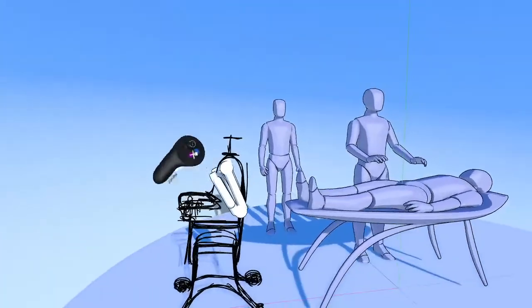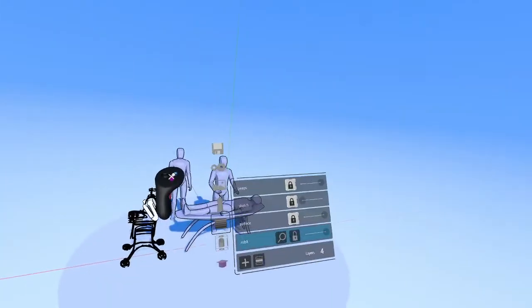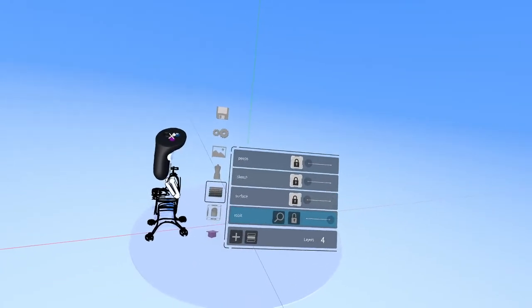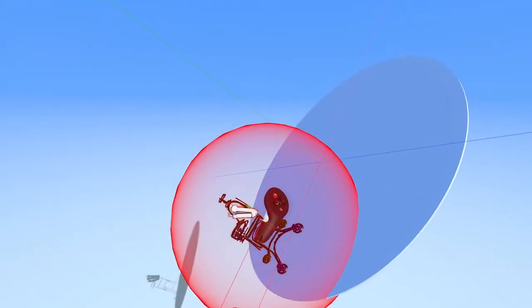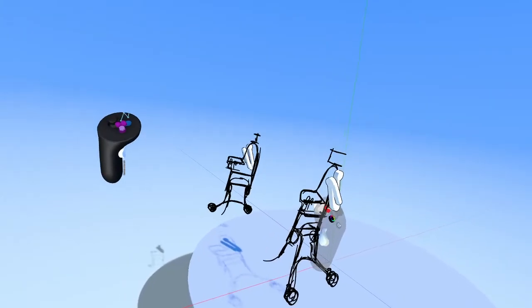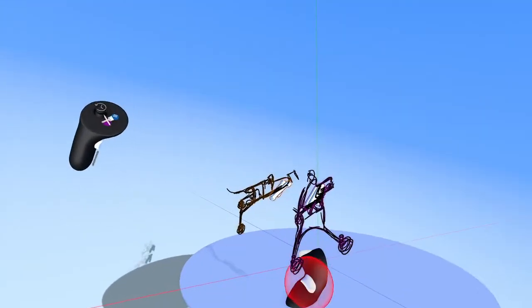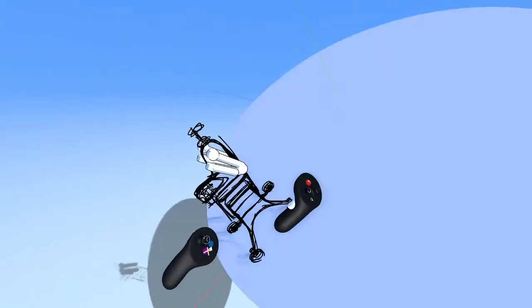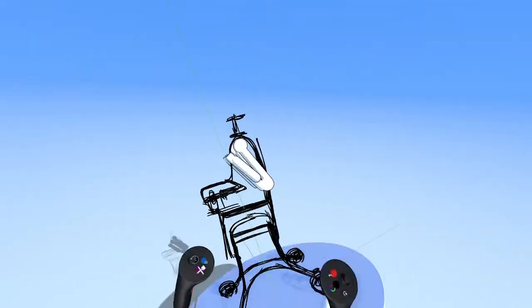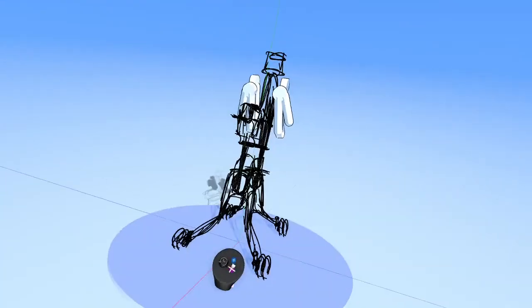And now what we're going to do is really zone in or hone in on this robot and get rid of everything else in the space here. So we're going to turn the visibility down by going to the layers panel. I'm going to grab all of this robot, all of the lines that make it up, and while I'm holding it, press the purple menu button, and that's going to allow me to group it like this so I can move it easier. And then I'm going to use Smart Move and move it somewhere near the center of our workspace here.